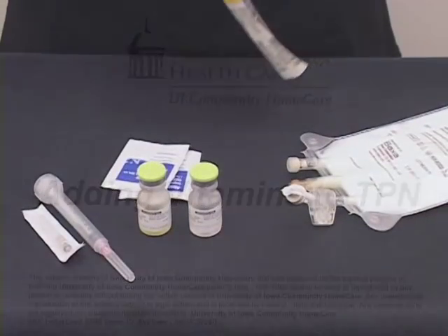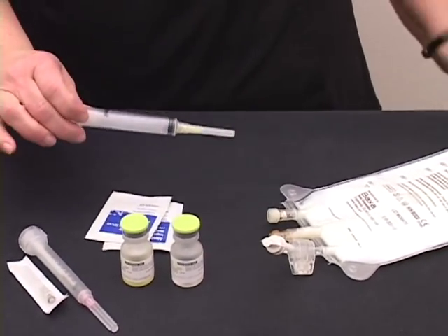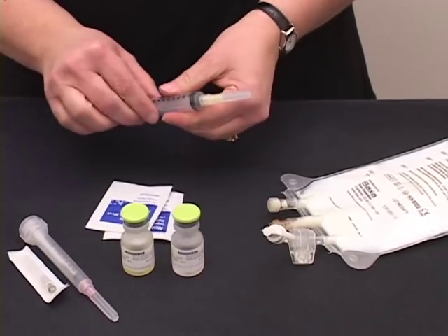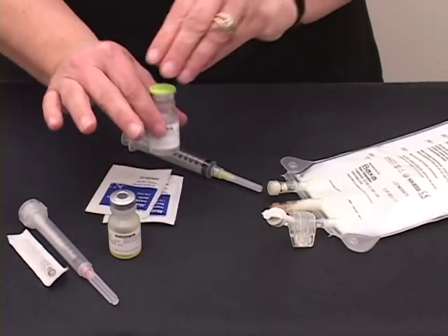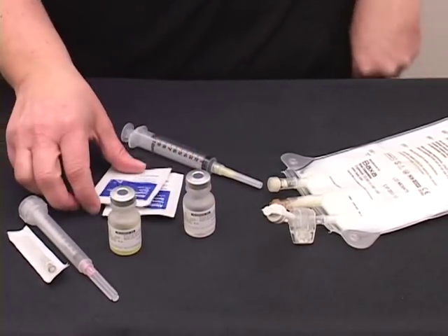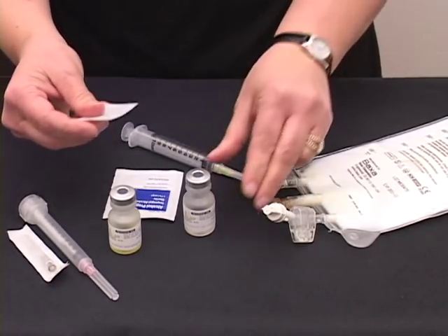To add vitamin to your TPN, start by opening your syringe, tightening the needle and setting it off to the side. Remove caps from both vials. Take your alcohol swabs and scrub off the rubber stopper on both vials.